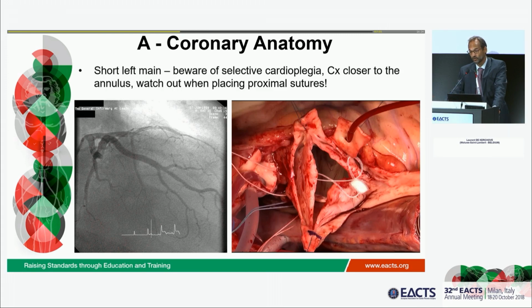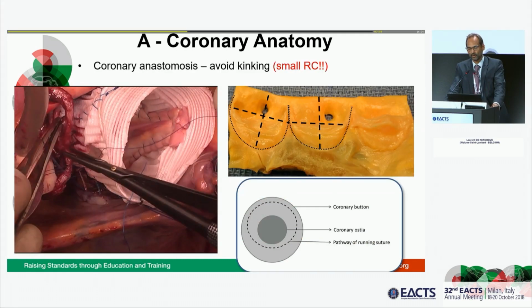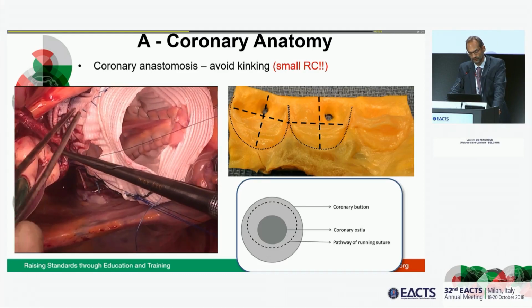We are not recording all our complications, so I cannot show you all of them. But when you have such complications, generally you don't think to record for a future meeting. But I hope to illustrate for you the moment of the operation. You have to be aware of the risk of your maneuver.